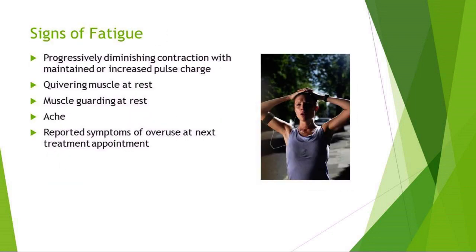Signs of fatigue are progressively diminishing contraction with maintained or increased pulse charge amplitude, quivering muscle at rest, muscle guarding at rest. The patient's going to report an aching feeling in the muscle. Or they come back to the next treatment and they go, man, I was so sore after that last treatment. That's a sign that you had pushed them into muscle fatigue.